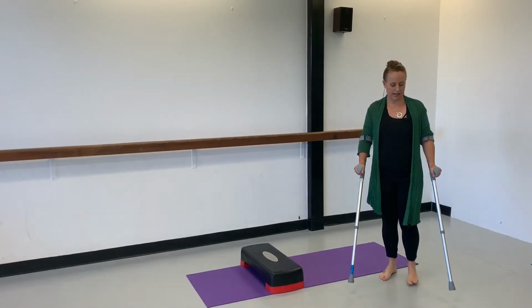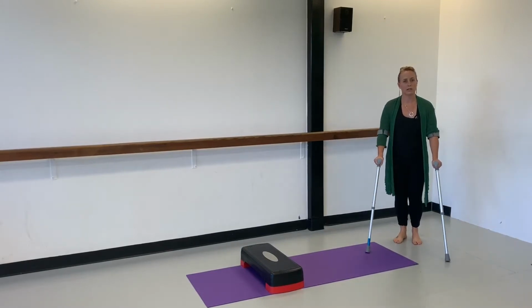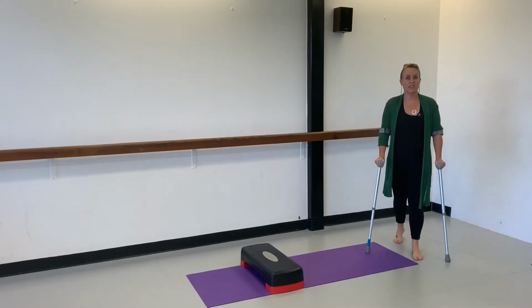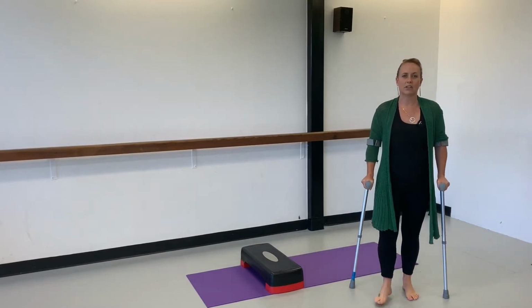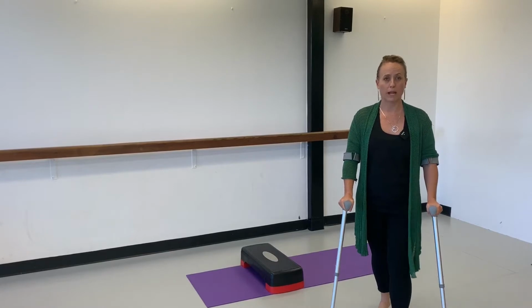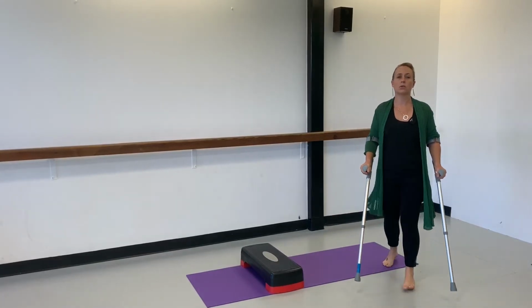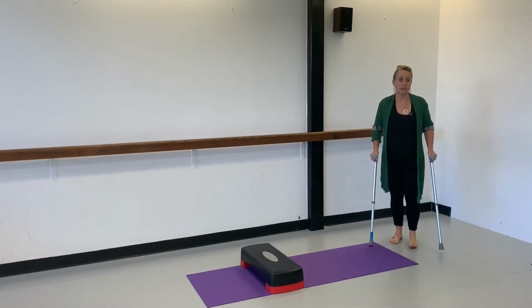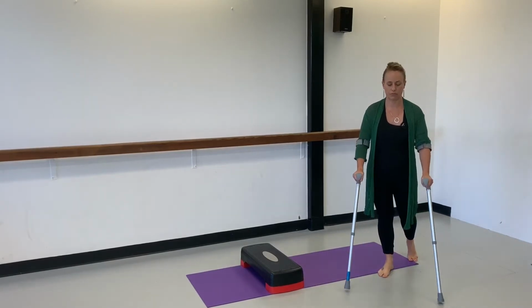To progress that onto crutches, you'll take your crutches forward, take your sore leg forward, and then step your good leg a little bit through. So that way you start to have a little bit more of a normal gait pattern, but essentially your crutches stay with your sore leg in order to feel supported. So crutches, sore leg, and then good leg through.